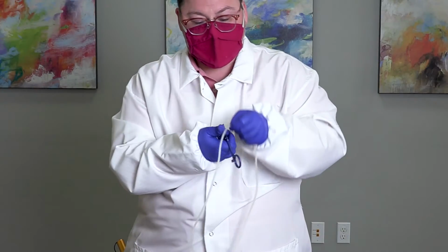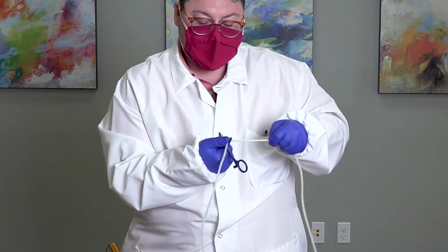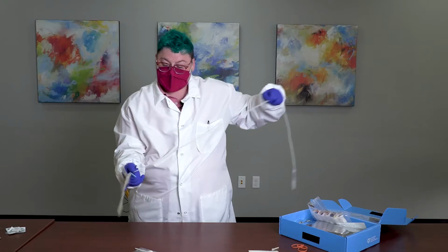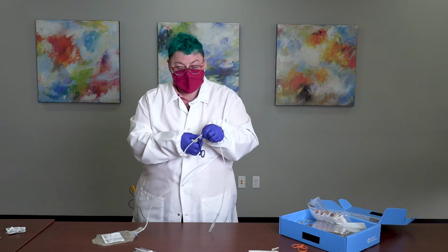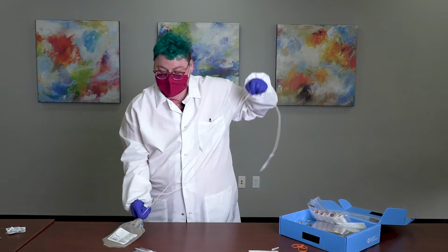To strip the tubing, you'll take the hemostat against your thumb and then slide it across. This is similar to curling a ribbon. We recommend doing this process twice. It is okay if the blood goes back into the tubing line, but the last time that you do it, you can go ahead and keep it there.